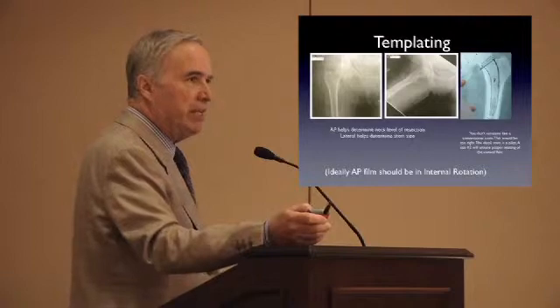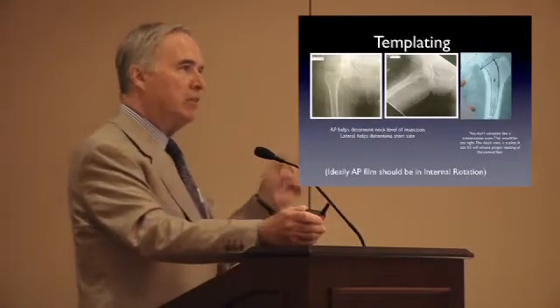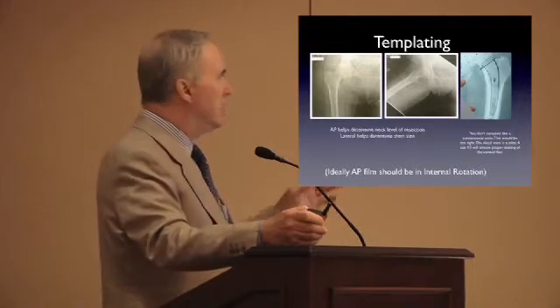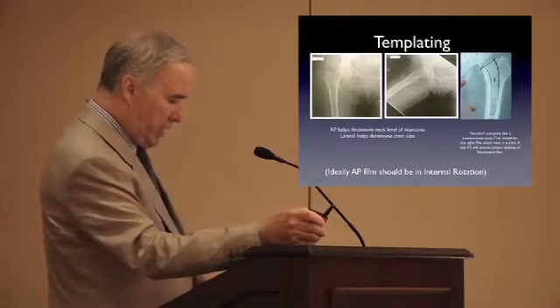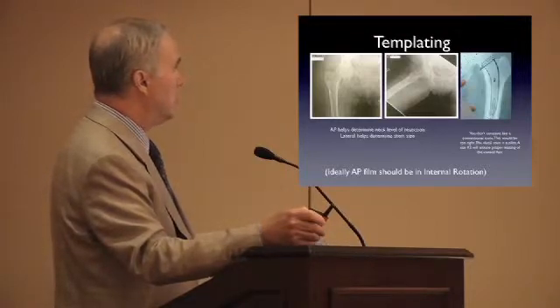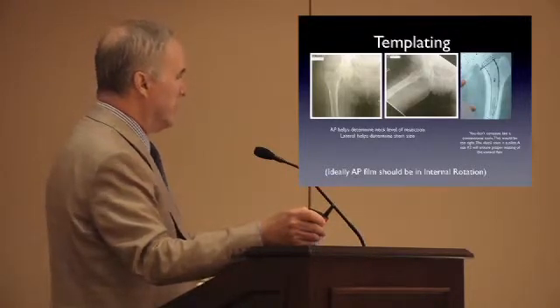With respect to templating, you're looking to fit the neck. You're not looking to fit the metaphysis or diaphysis, so don't pay any attention to what's going on in this region. You're looking at the neck. This is an oversized templating here.